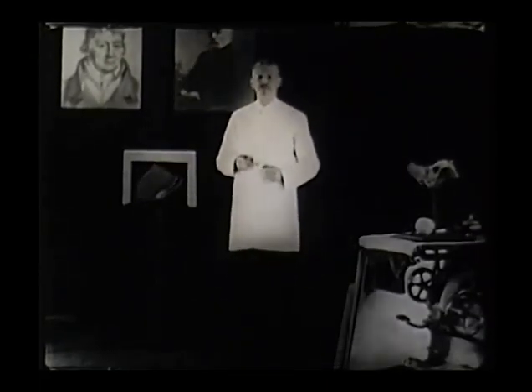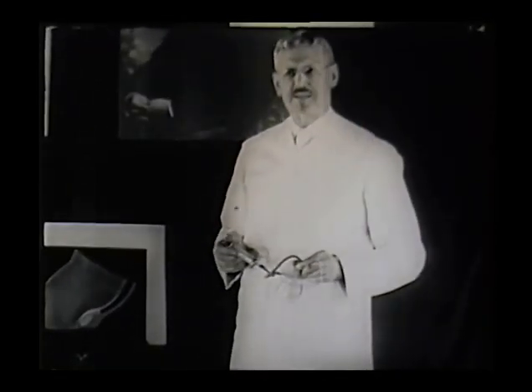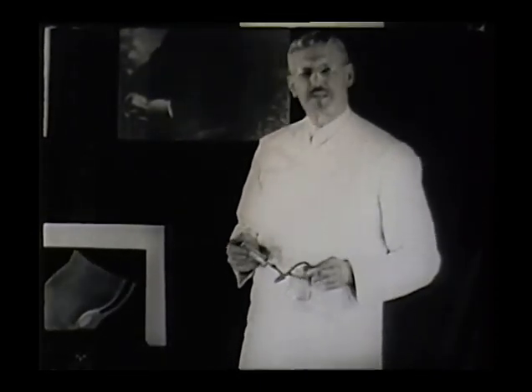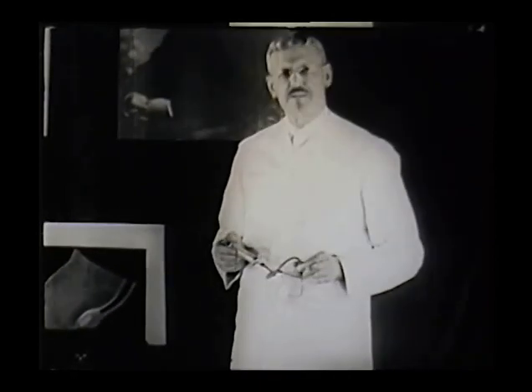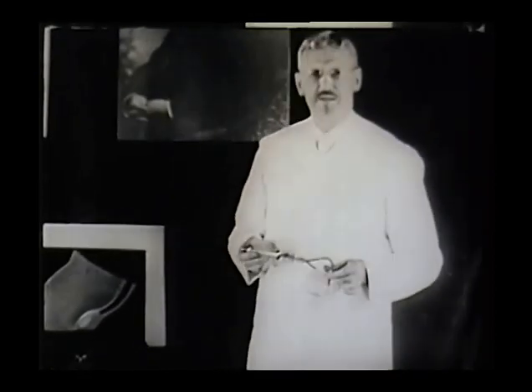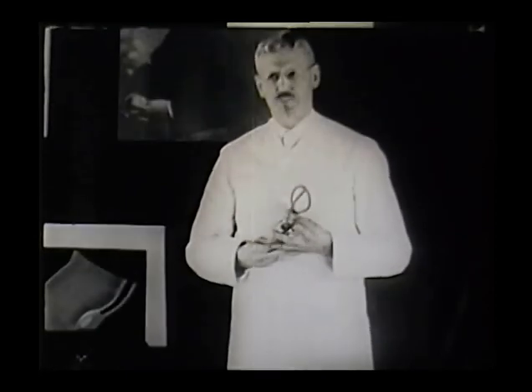Now, gentlemen, a few words about local anesthesia. It is particularly well adapted to the low cervical cesarean section, and I prefer it to spinal anesthesia, indeed to general anesthetics too. No one can deny that spinal anesthesia is more dangerous than the local infiltration, and since we can, in 90% of the cases, succeed with local infiltration anesthesia, this should be the method of choice. And I have here in my hand the instruments that we use at the Chicago Lying-In Hospital. They facilitate the operation, but ordinary syringes will do the work just as well.